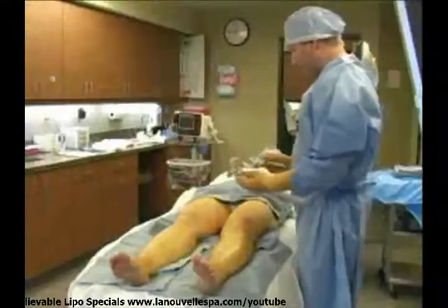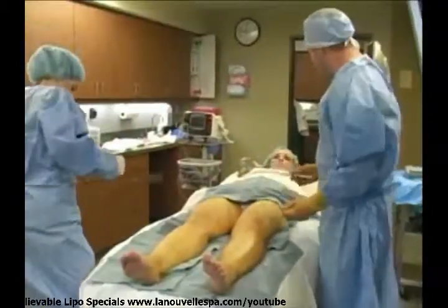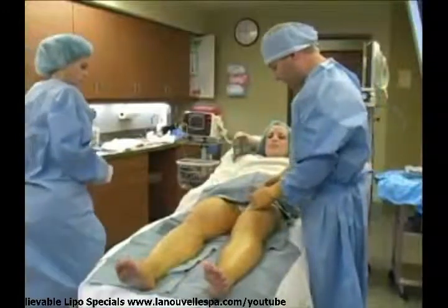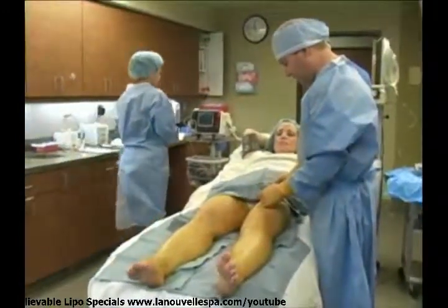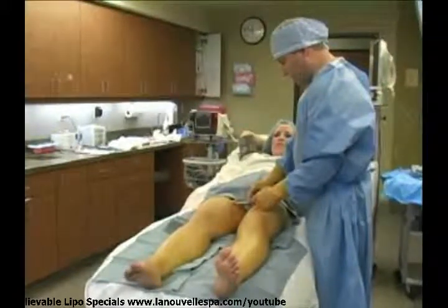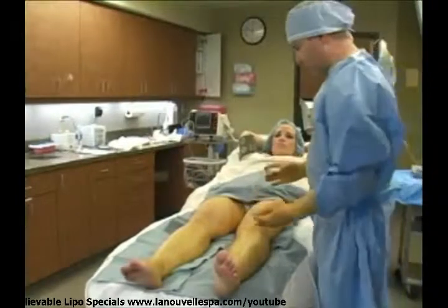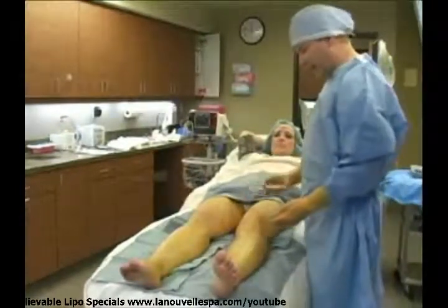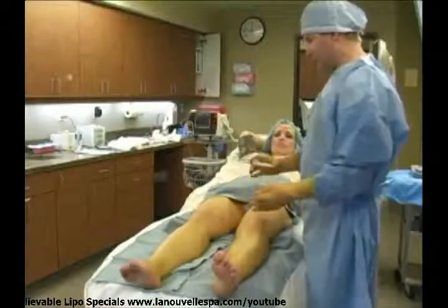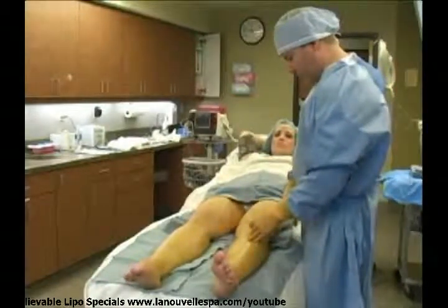So during this part, we're just going to make our little incision points, and we're going to fill things up with the local anesthesia. Same thing that you went through before. Local anesthesia burns a little bit, a little poke here. Can you feel that? It gets numb quick, and this allows us to do it under local anesthesia while you're awake. It's really the only way to sculpt areas like this because I'll have to stand you up at the end and make sure we got things right.